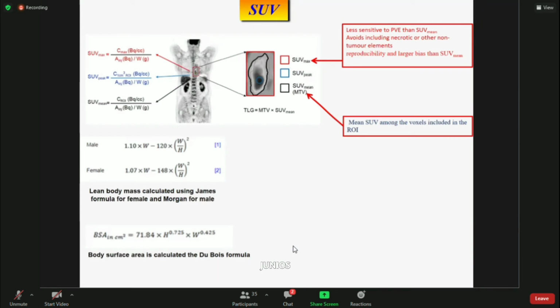First, accurate staging and diagnostic information do not have to depend upon accurate image quantification, since the relative image content, that is image appearance, is often sufficient for such purpose. Second, measured SUVs have a large degree of variability due to physical and biological sources of error, as well as inconsistent and non-optimized image acquisition, processing, and analysis.